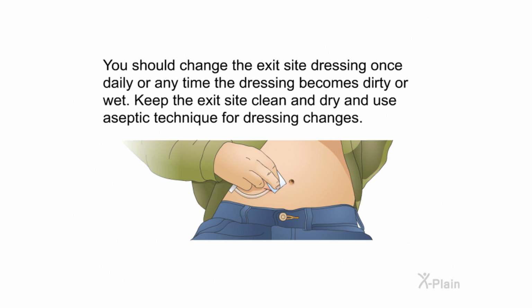You should change the exit site dressing once daily or any time the dressing becomes dirty or wet. Keep the exit site clean and dry and use aseptic technique for dressing changes.